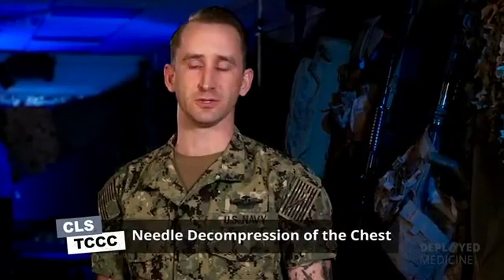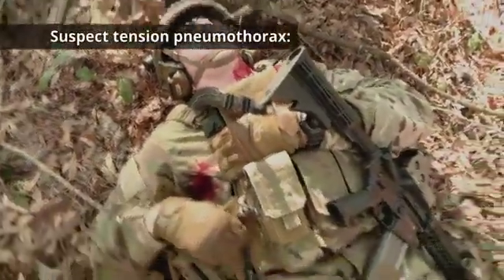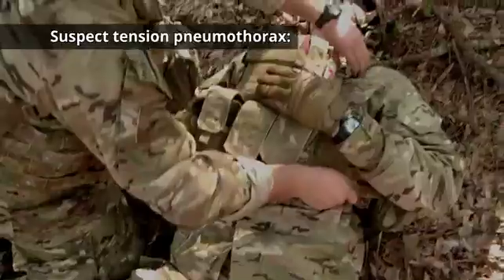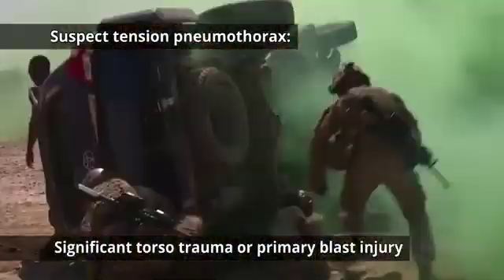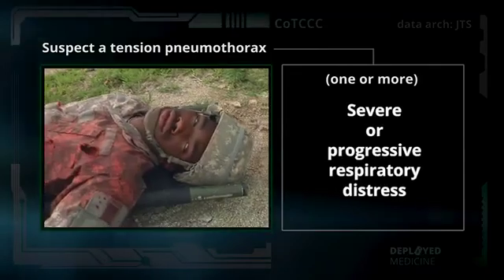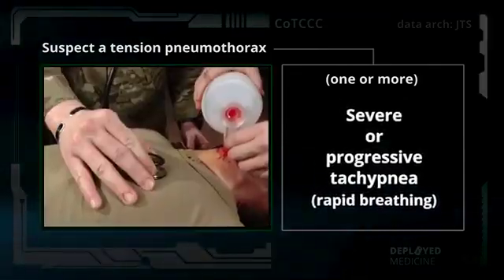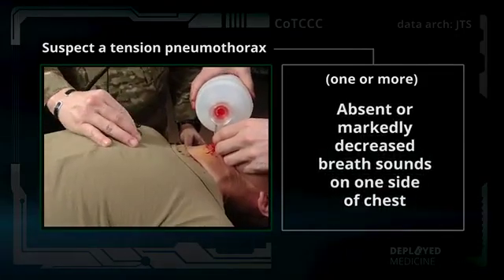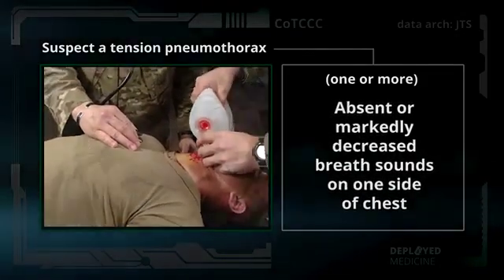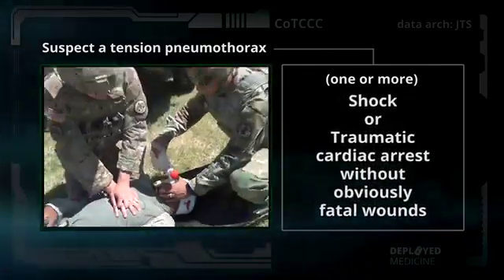Today I'm going to be teaching you about the needle chest decompression to help alleviate a tension pneumothorax in a casualty. Suspect a tension pneumothorax and treat when a casualty has significant torso trauma or primary blast injury and one or more of the following: severe or progressive respiratory distress, severe or progressive tachypnea, absent or markedly decreased breath sounds on one side of the chest, shock, or traumatic cardiac arrest without obviously fatal wounds.